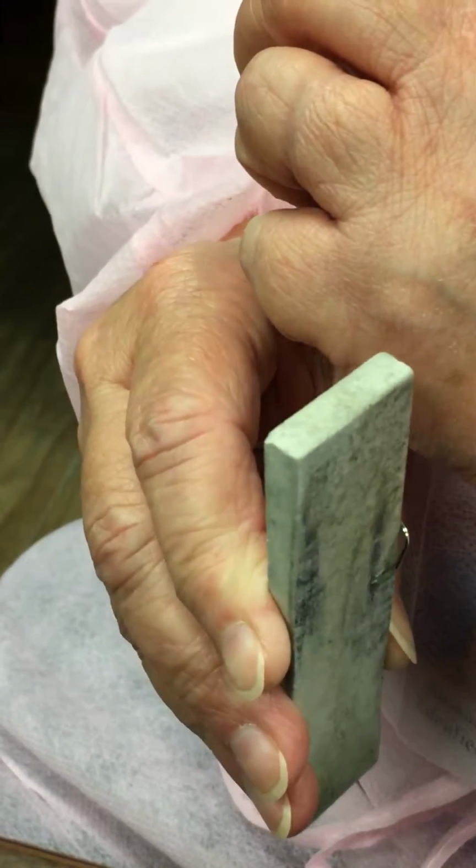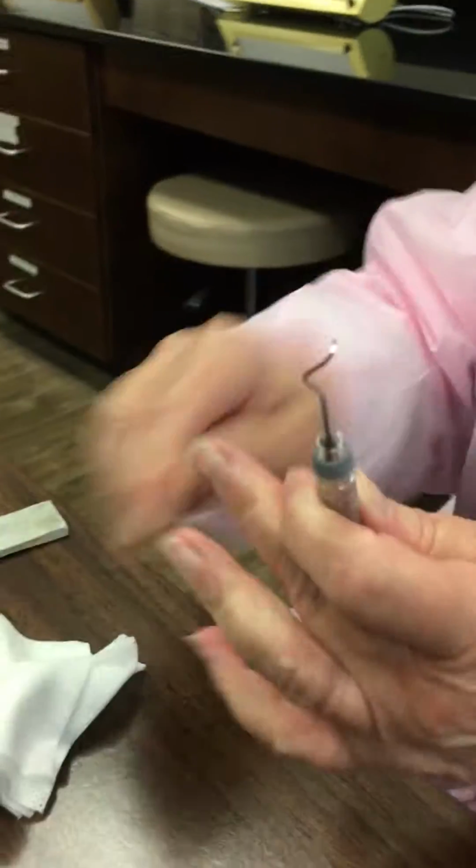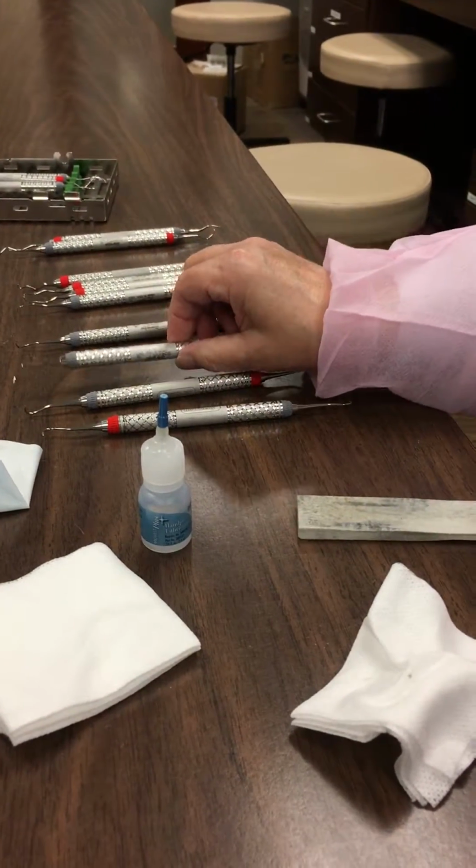The duller that your instrument is, the longer it's going to take you to sharpen. A rule of thumb is the more frequently that you sharpen, the less of the instrument you have to sharpen at one time.